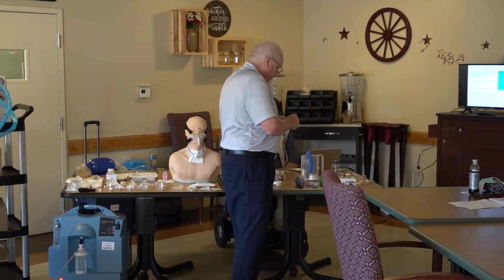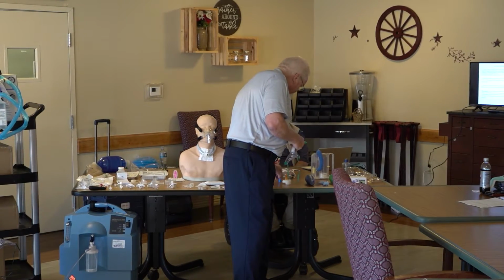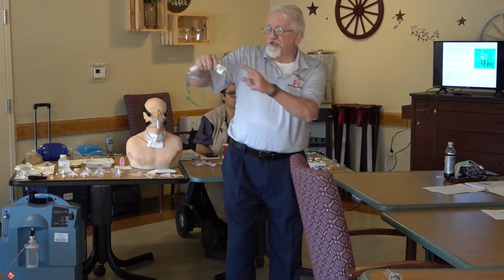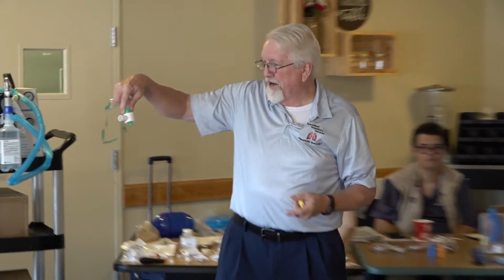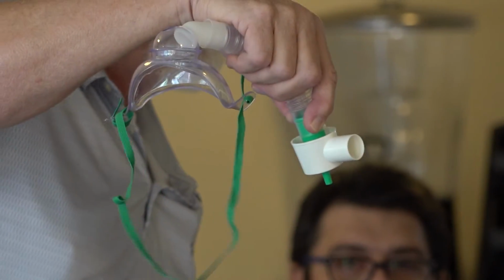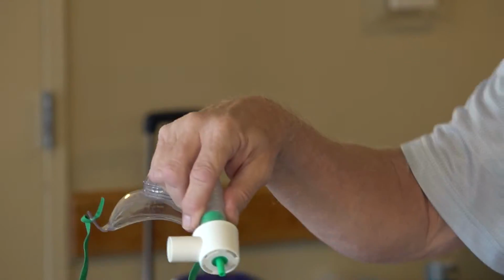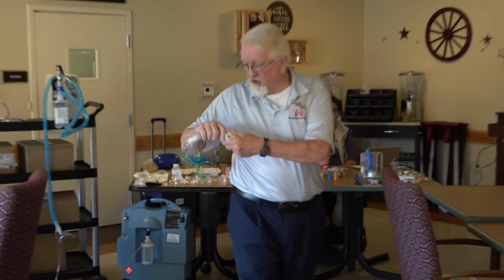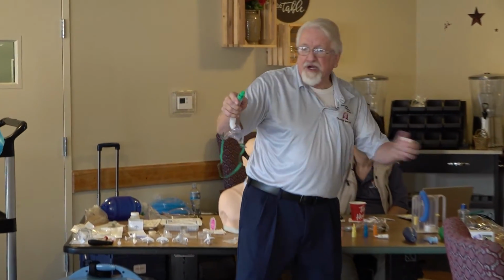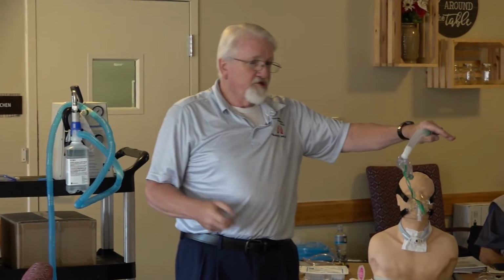And one other thing I want to make sure I explain, because some folks think this is to give a nebulizer treatment. This little cup here, do you know what it's for? And it's not to give a nebulizer treatment. Any idea? No. It serves a purpose. If I didn't have that little cup on there and I was wearing this in the bed and my covers came up and covered it, I'm getting straight oxygen.